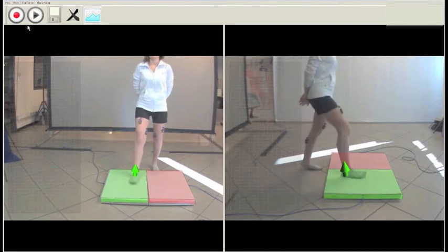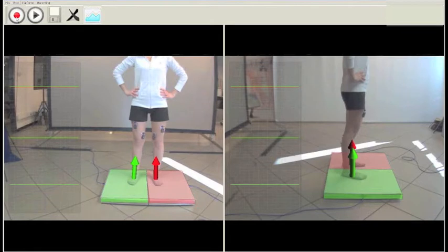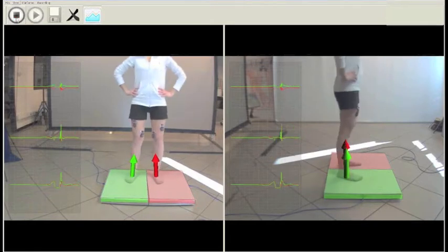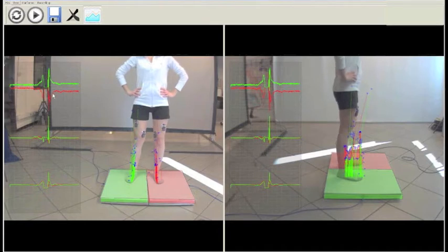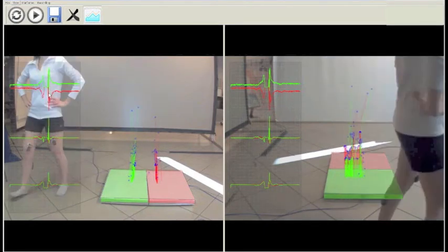So she has to stand over the platforms, hands on hips, and when I'm going to give her the starting condition, she starts to jump. So I click on start recording, and then she can start jumping. While she stops, I stop the recording, and as you can see, here we have the three components of the ground reaction force for both platforms.